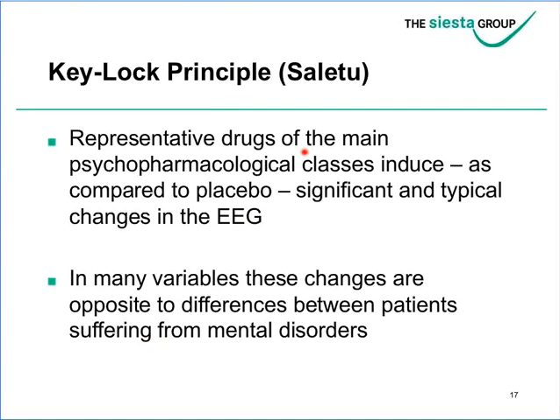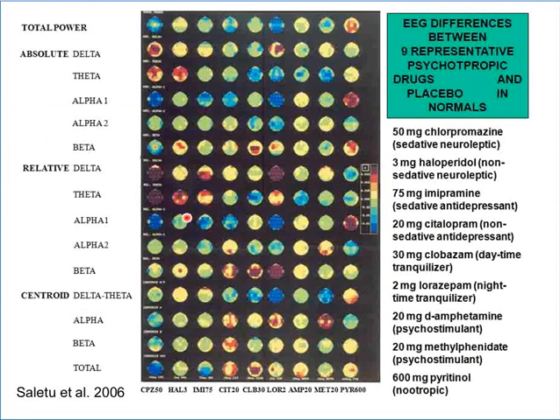From these observations, the two very often complement each other and give you a very good indication about which disease or pathological picture a certain drug or drug class might be best targeted at.